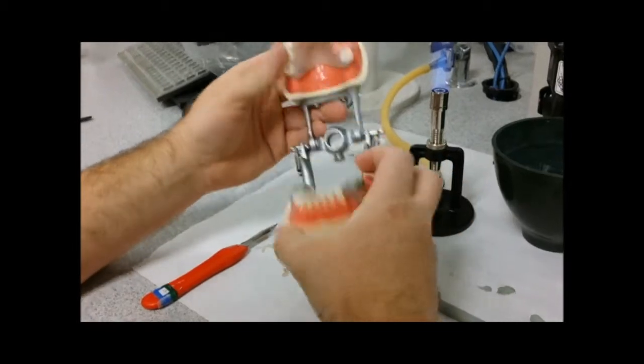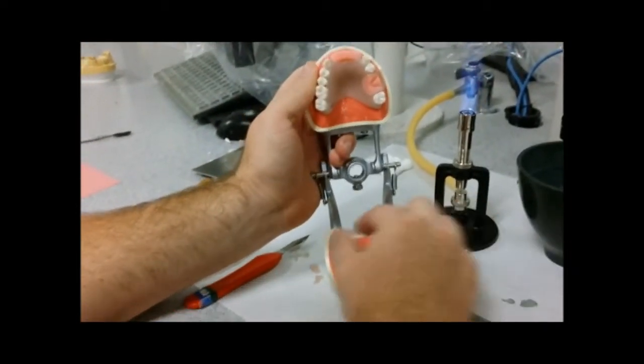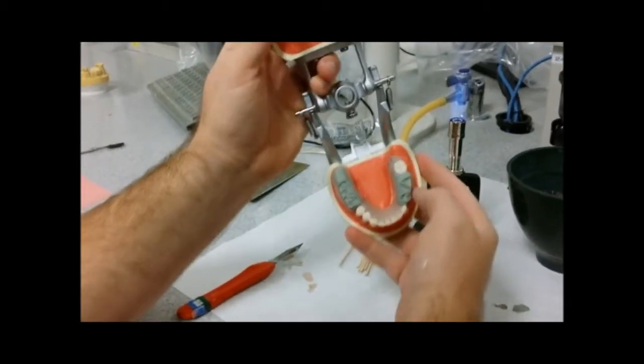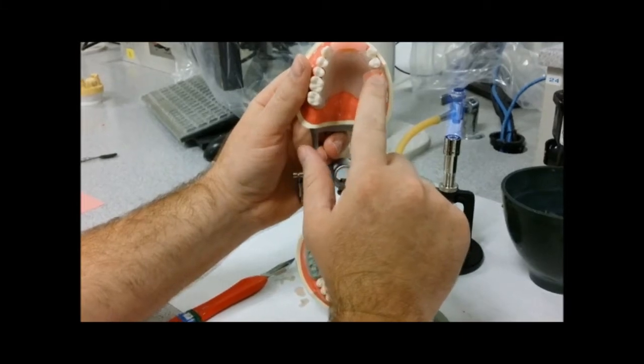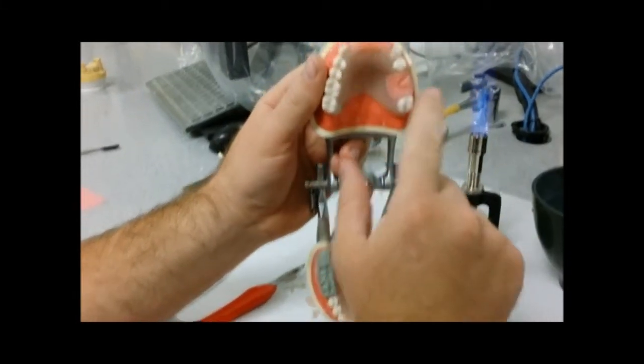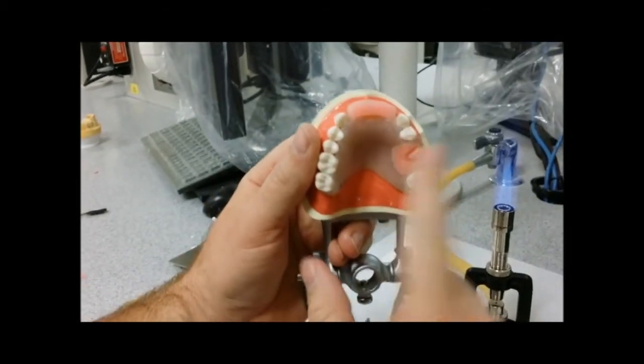This is my project from last year. So once you do the gray stick compound, you're going to take the bite registration you'll get this right here. You've got to make some non-parallel V-shaped grooves. Make sure they don't have any undercuts in them because if they do have an undercut, once you take the gray stick down, it's going to stick in it and it'll get stuck and break off your wax.